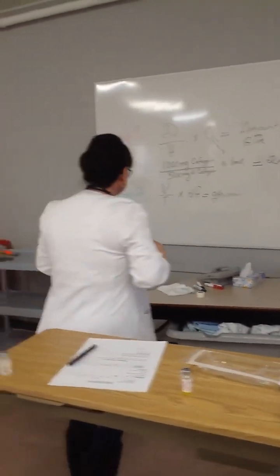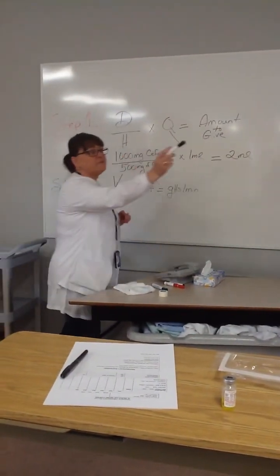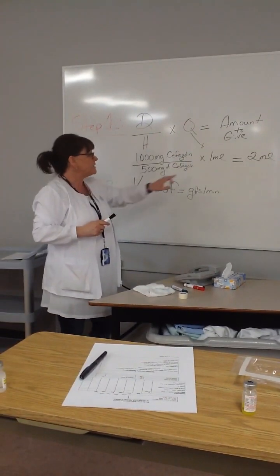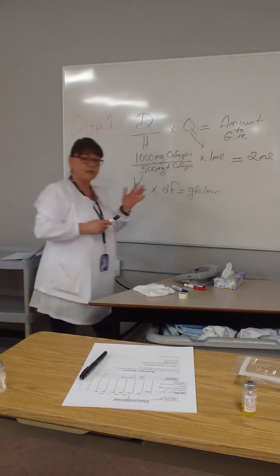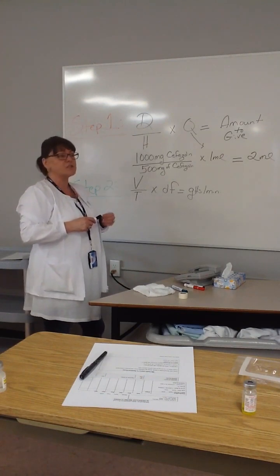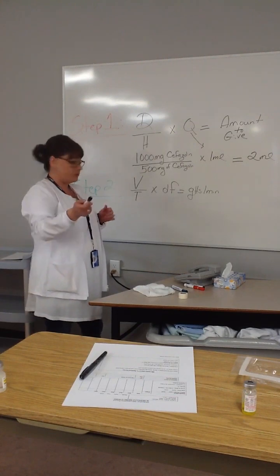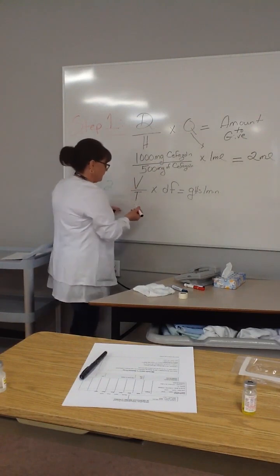So, I'm going to come over here. Stay with me for one more minute. Our volume is that 50 mil bag. That's our new volume. There is 2 mils, we could say 52 mils. You'll get a bit of a decimal point in your calculation. According to best practice, you do not have to add anything under 10 mils to your little 50 mil bag. So we're just going to say a volume of 50 mils.